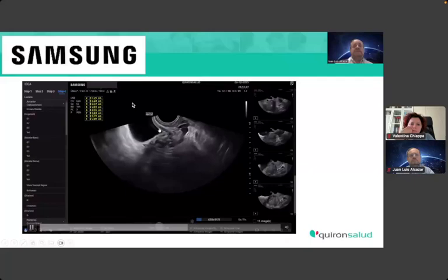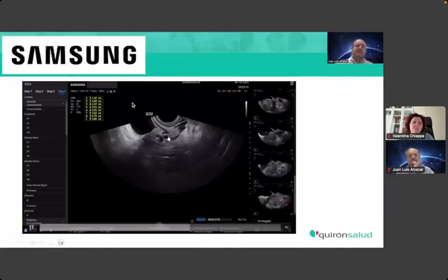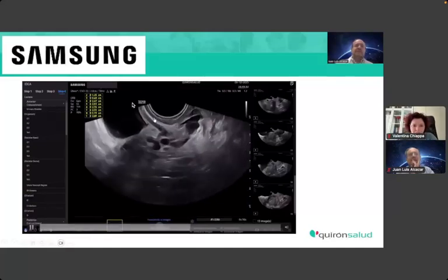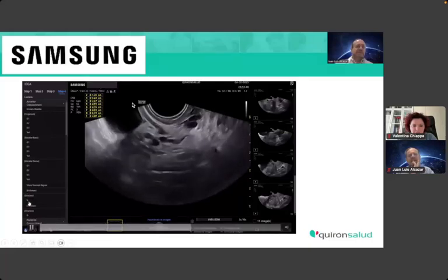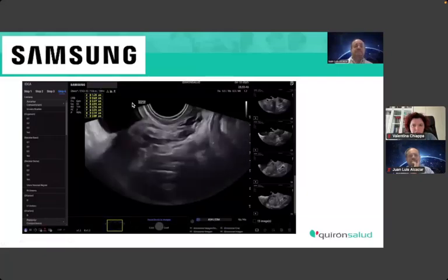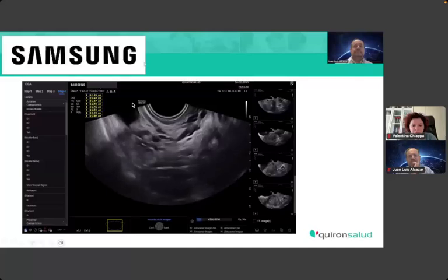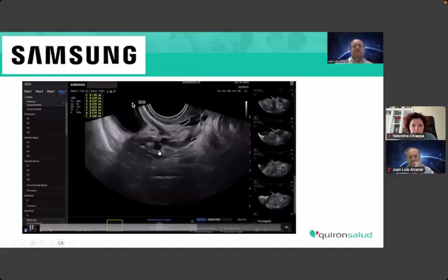This is the contralateral ureter, looking for the movement of the ureter, the presence of any sign of dilatation of the ureter. You see dilatation, yes or not. Depending on what you see, you should mark yes or not. Here we are. Again, the ureter right there. Yeah, actually, this is already the parametrium, the lateral parametrium, which is the uterine vessels and the ureter right there.